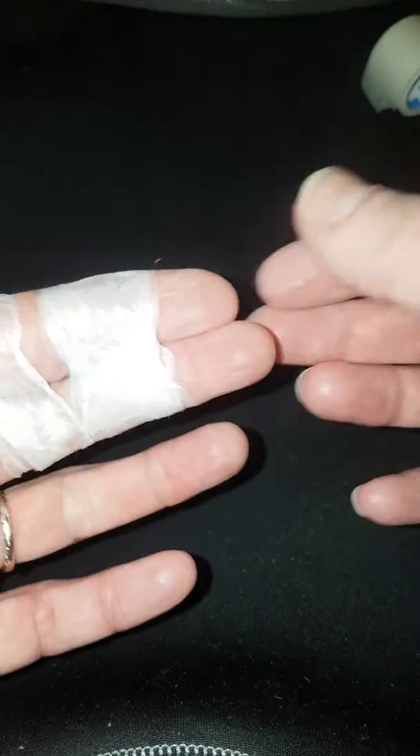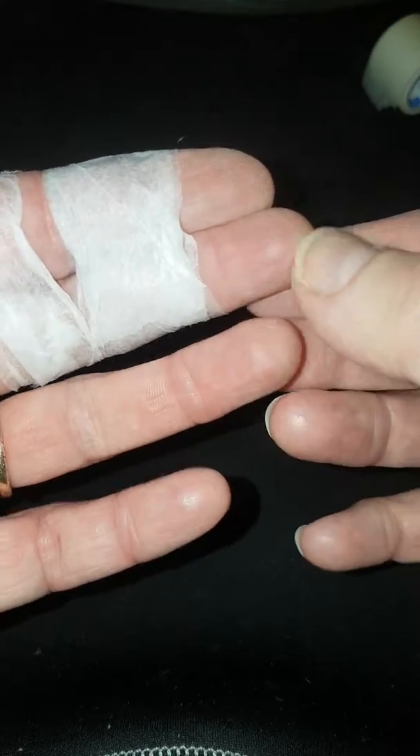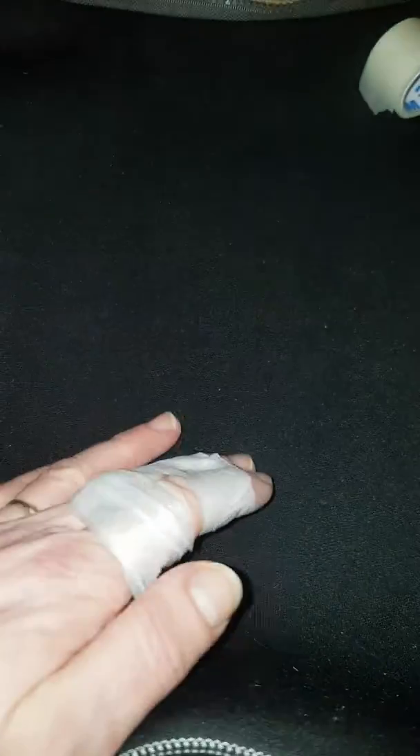Make sure you can still bend, make sure you've still got a capillary refill, that it's warm and it doesn't tingle — and bob's your uncle, that's it.